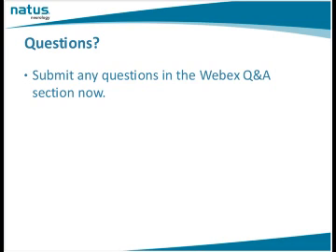Okay, thank you, Katie. We have another question. Is terminal ICA okay for substitute if the submandibular ICA is not available, like if the patient has a C collar? The answer to that is absolutely not.